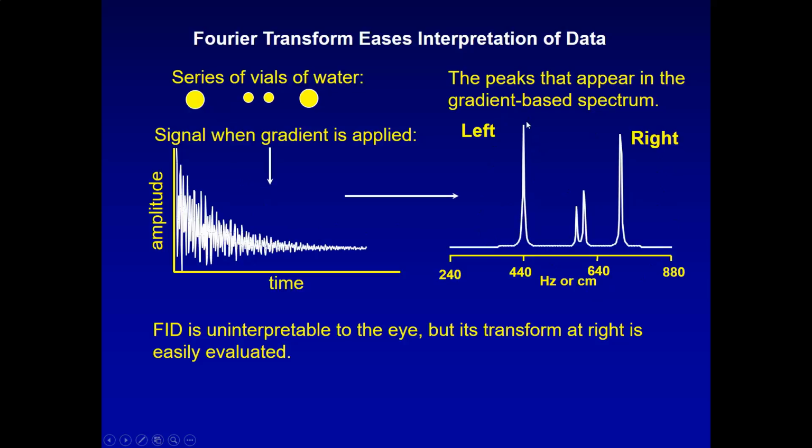Here, this is a peak that represents the main water peak on the left, and here's the big water peak on the right. The two little water peaks in the middle. Only now, if we do a Fourier transform, this is time or reciprocal space. Now here we're talking hertz or centimeters. There's no way to tell the difference between this and a regular chemical spectrum.